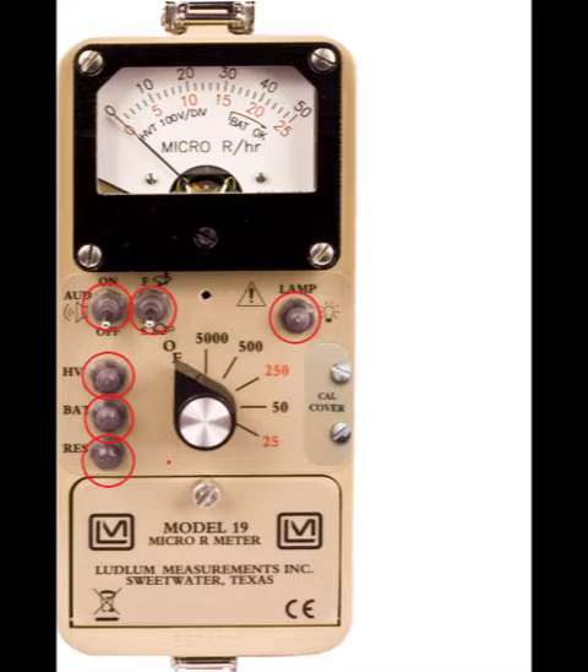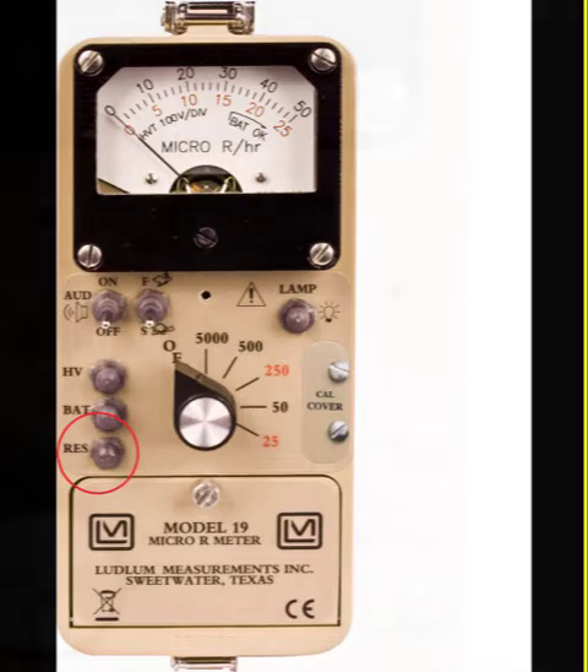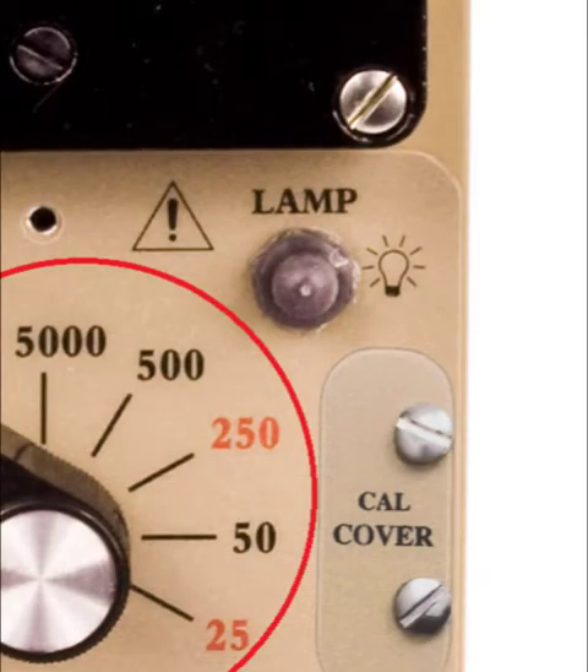The front panel controls are: an audio on/off switch, a fast-slow switch for the response time of the meter, a lamp push button to light the meter display, a high-voltage test button to display the high-voltage setting, a battery test button to test the battery voltage, a reset switch used to drive the meter needle back to the zero position, and a rotary switch to turn the meter on and select the active range of the instrument.